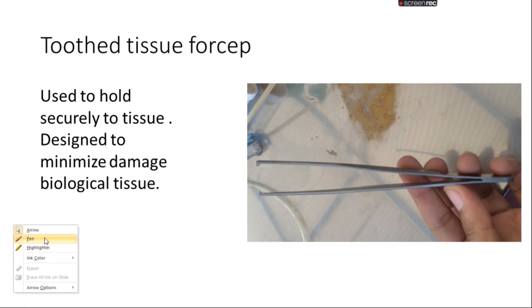Toothed tissue forceps are similar to tissue forceps but have pointed teeth. They are used to hold securely to tissues and are designed to minimize damage to biological tissue.